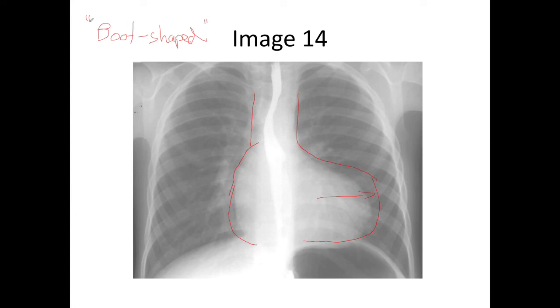You'll notice that we will provide you with other radiographic images as the trimester unwinds to demonstrate cardiac tamponade versus left ventricular hypertrophy. All of these are going to be indications for cardiomegaly, which we'll get to next week.